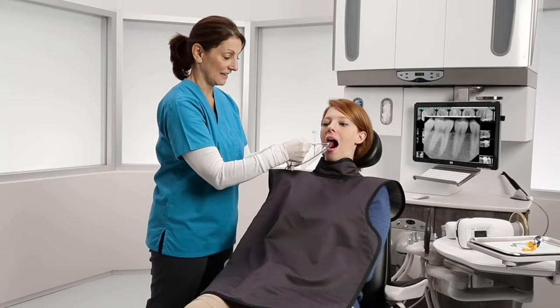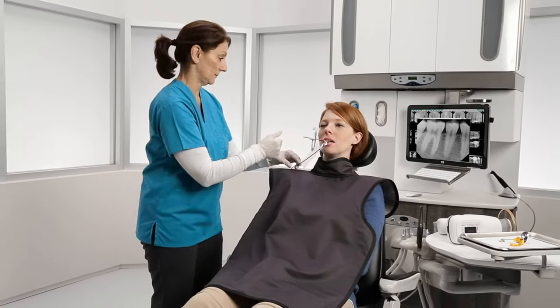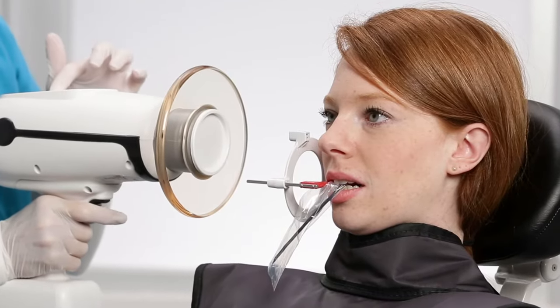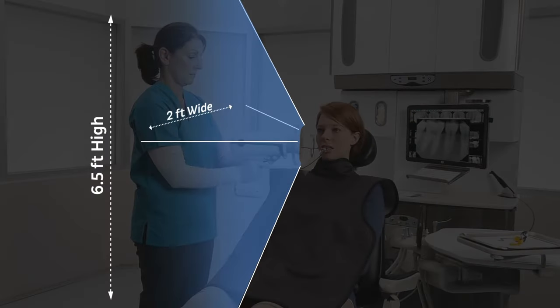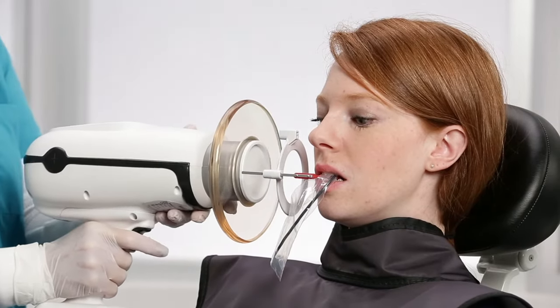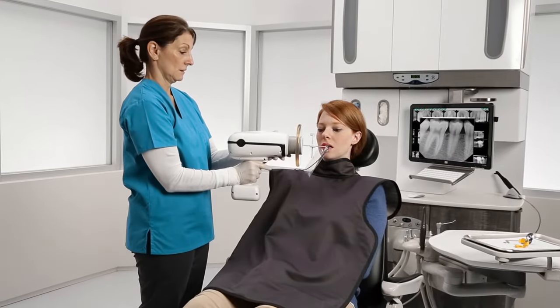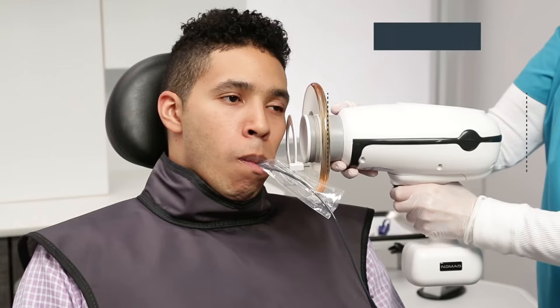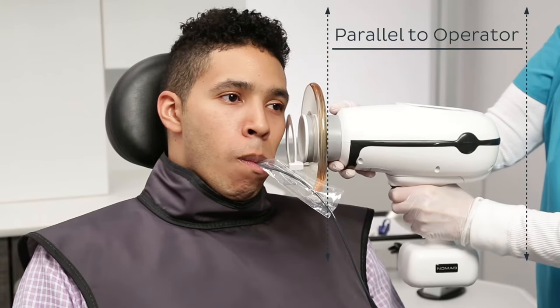When held properly, the backscatter shield can provide an effective protective zone in which the operator can safely stand while operating the Nomad. The protective zone for the Nomad is six and a half feet high by two feet wide. It is important that the operator remain in the protective zone as much as possible. To receive the maximum benefit of the protective zone, it is important that the backscatter shield is parallel to the operator and not angled when positioning.